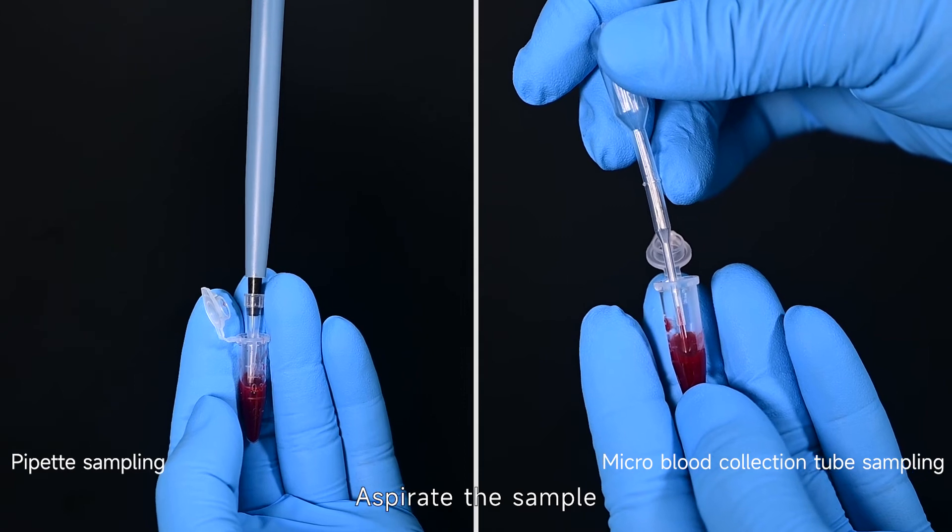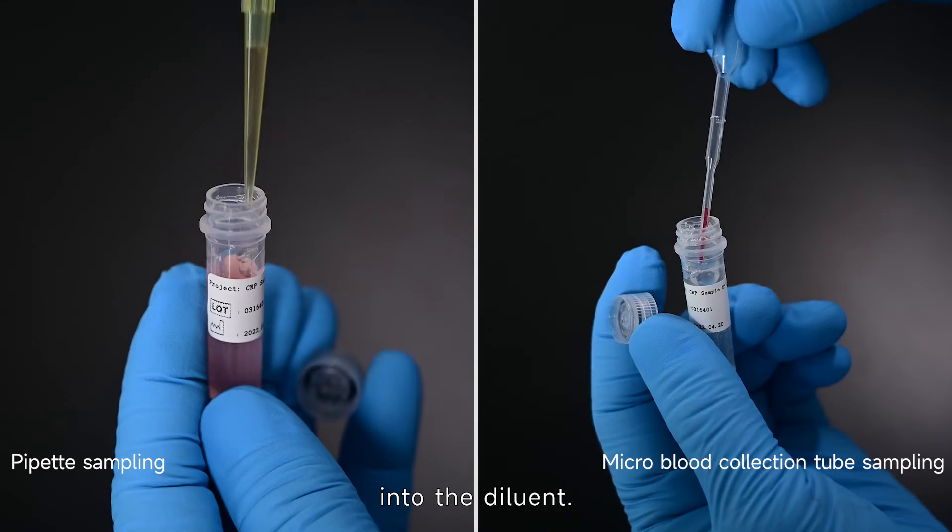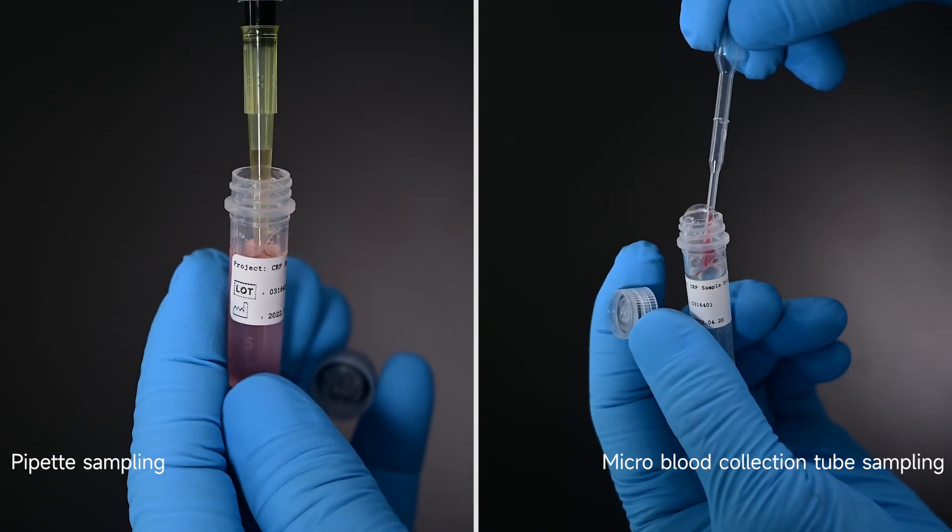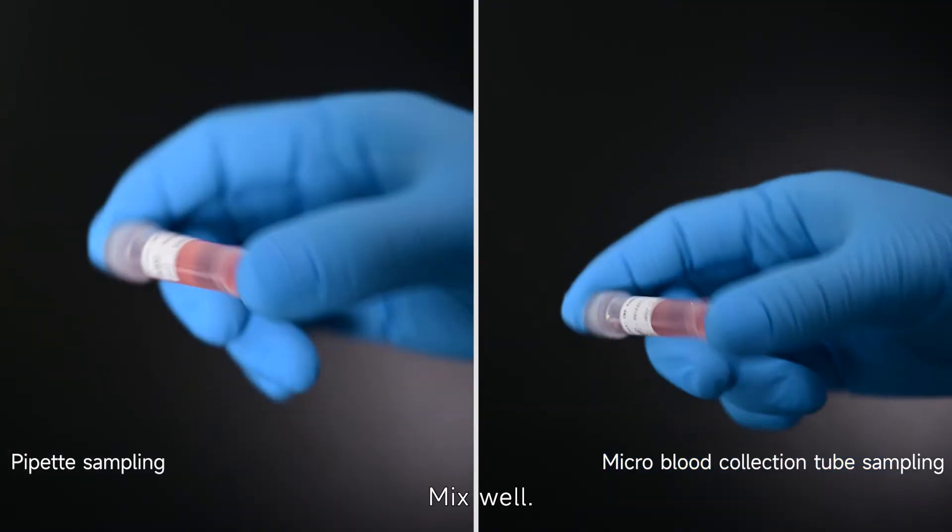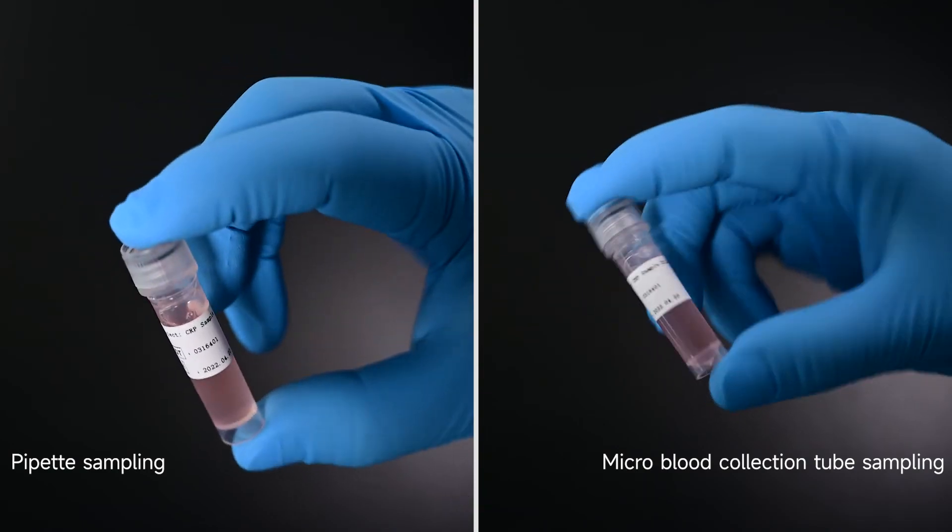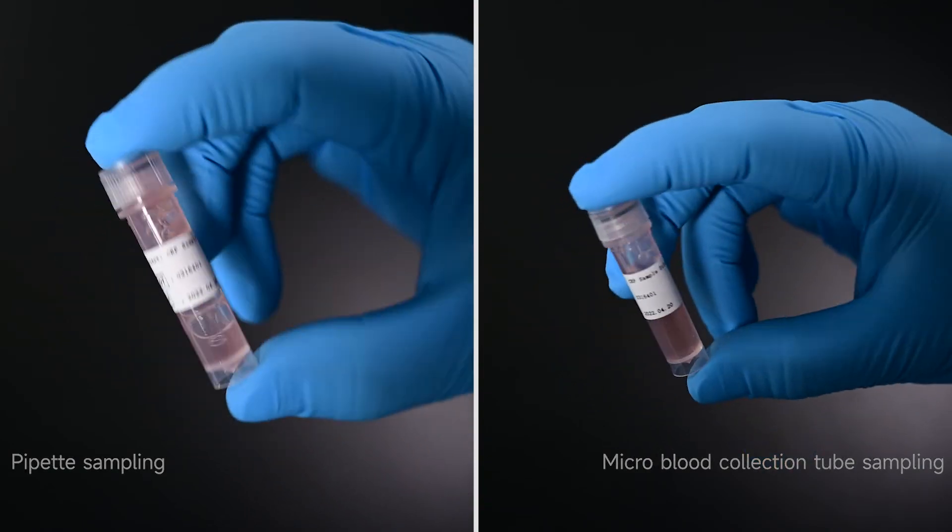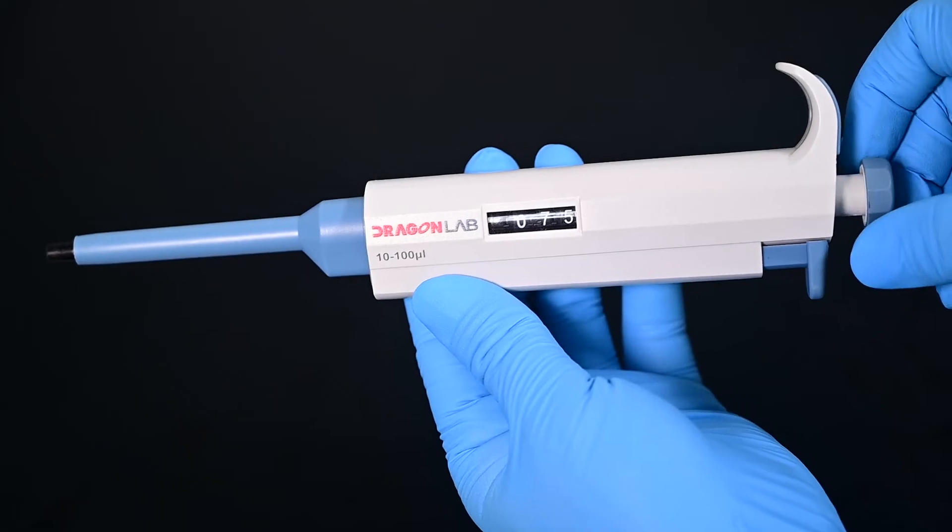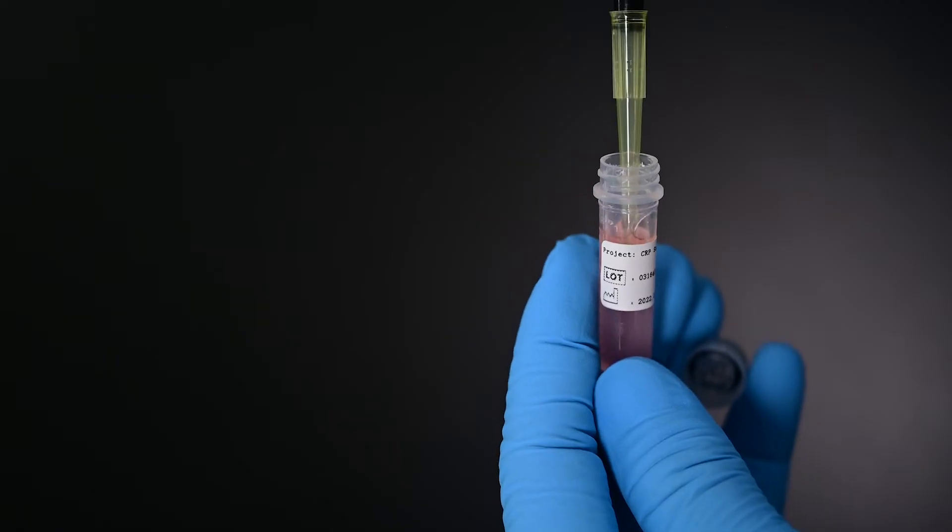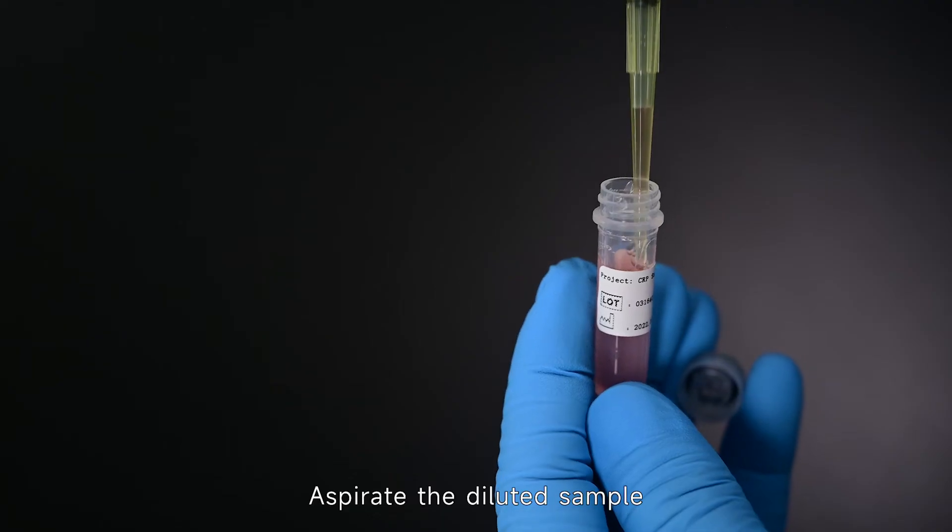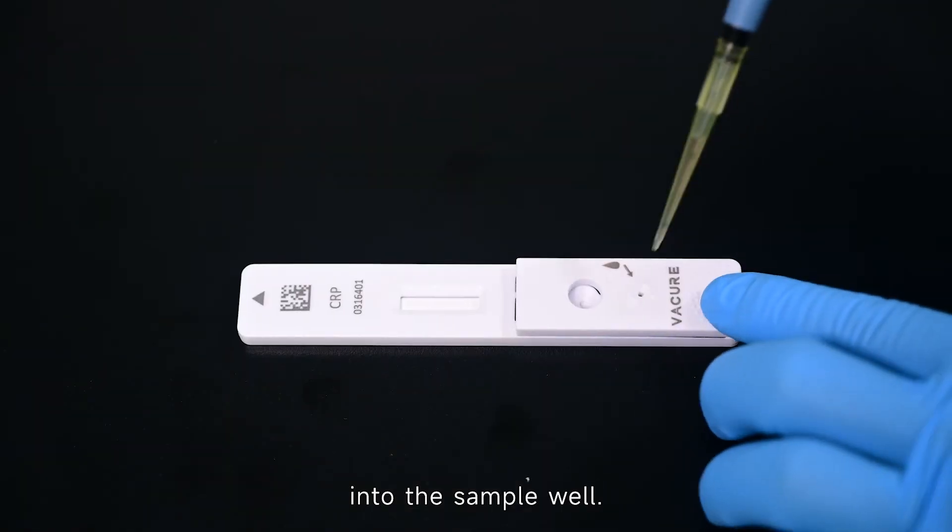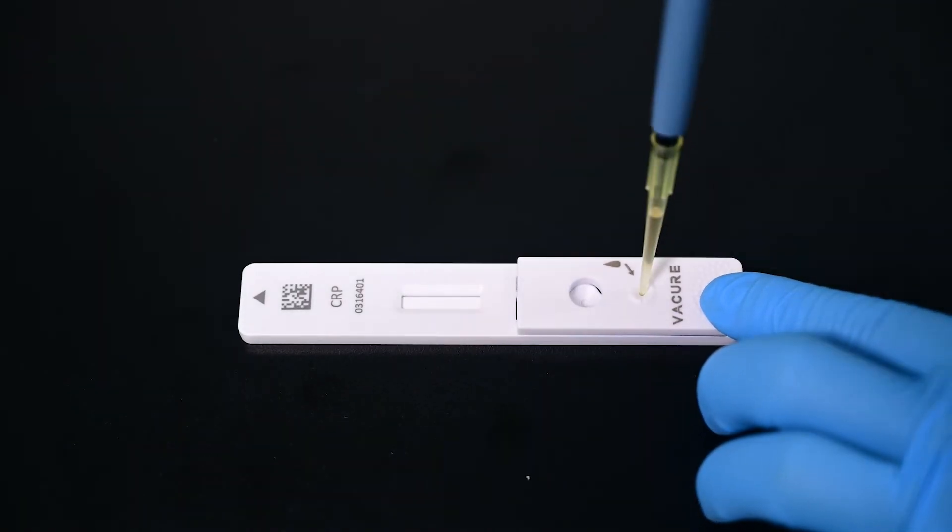Aspirate the sample into the diluent and mix well. Aspirate the diluted sample into the sample well.